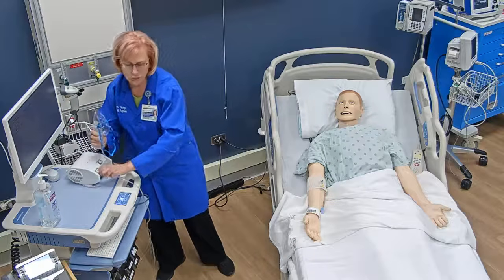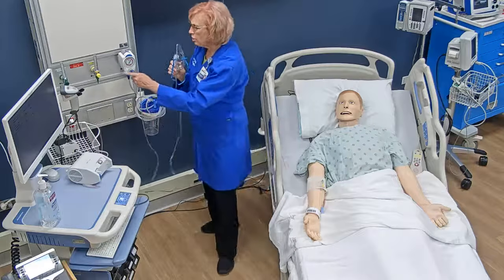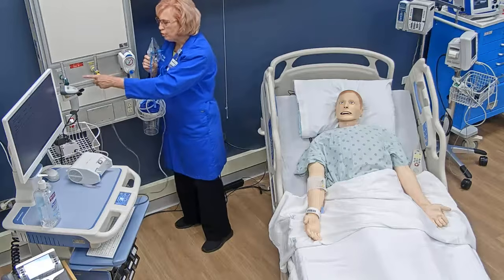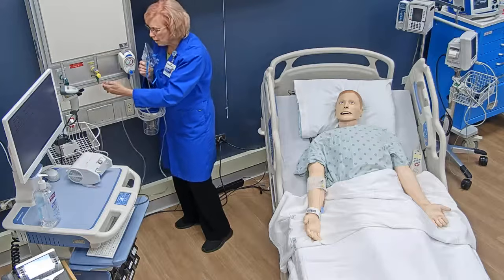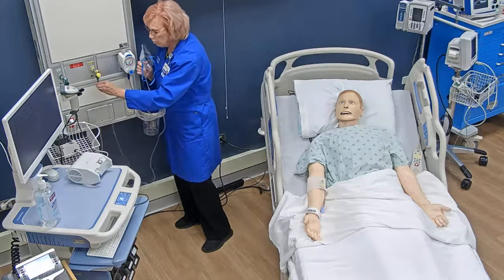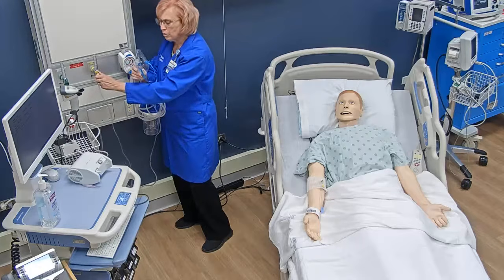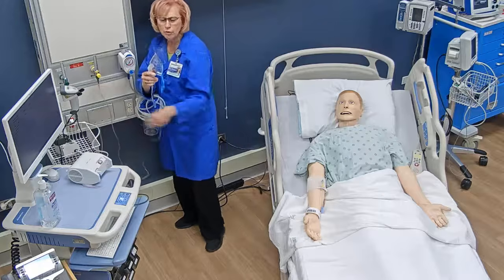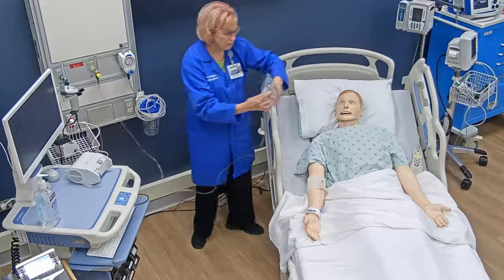In the hospital, they usually do not have these machines, so instead they hook it up right to the oxygen flow meter. Remember, your oxygen flow meter is always green. Here in Harper Hospital, we use the medical air to simulate oxygen. So I would hook up my tubing here, and I would turn my flow meter up until I see that mist. I don't know if you can see the mist on the camera or not. I can see it, so I know my medicine is ready to be delivered.